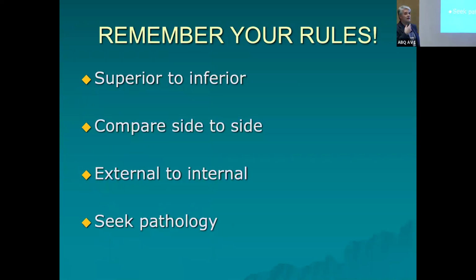Okay, rules that I teach. I teach x-rays and radiology, and I teach advanced health assessment to nurse practitioners and nurses. We want to take more of a superior to an inferior approach. We want to work our way top to bottom, and we always want to compare side to side, one side compared to the other side, because it's going to be a good mirror image for the most part. We're going to learn to work external to internal, and if I can get nothing else into you today, it is learn to seek pathology. Don't assume normal.